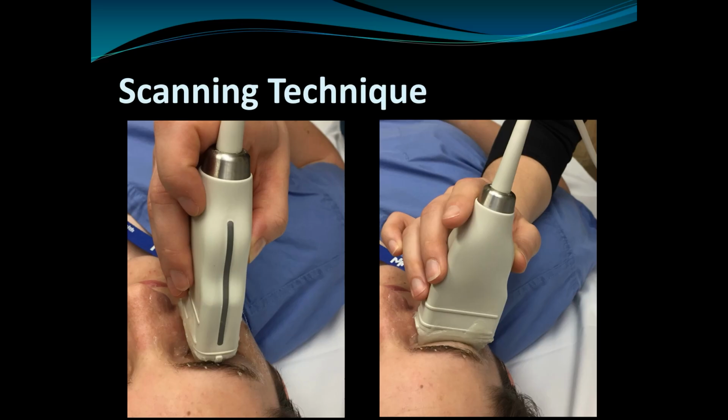So our scanning technique, we're going to use a linear probe, a high-frequency linear transducer, and just like everything else, we're going to scan in the transverse and the sagittal planes, so orthogonal planes. It's really important in ultrasound of the eye that you anchor your arm or the base of your hand when you're doing this, so you're not putting a lot of pressure on the globe. So you want to anchor your arm. You can see in the picture on the right that the arm is actually anchored on the patient's shoulder. Some people actually use the base of their hand and anchor it on the patient's cheek.